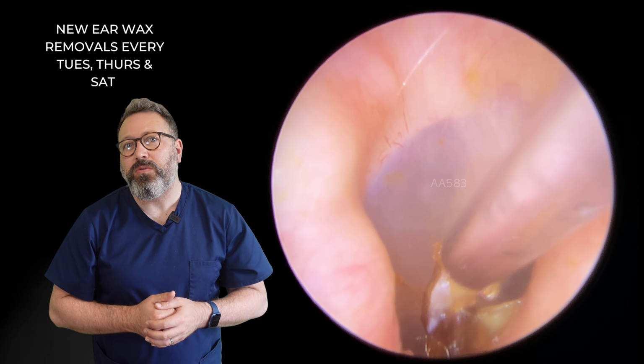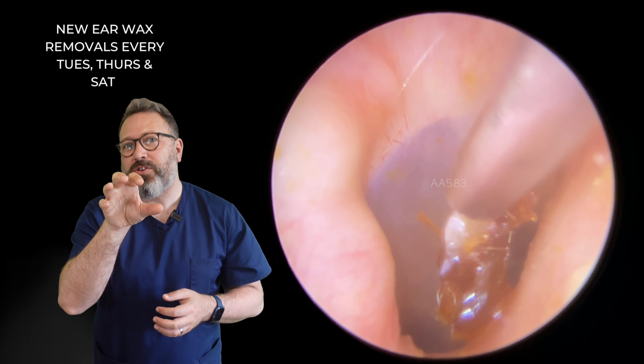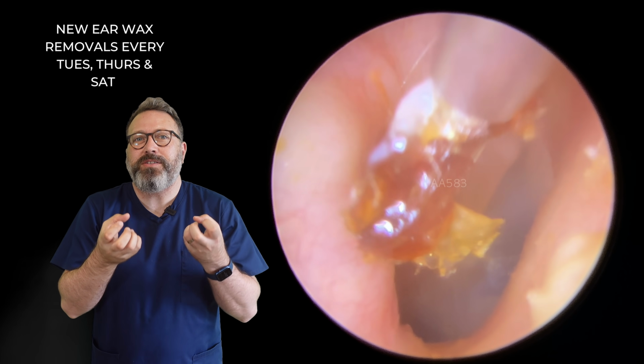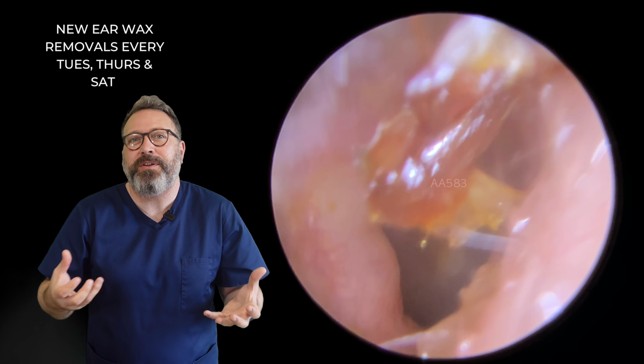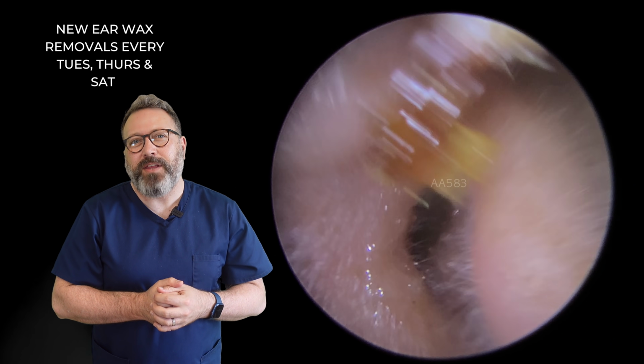So we're going to hold this on with the suction. Let's let the suction build its pressure a little bit just on this particular section, and there we go. That's the grip we needed. You can see it detach a little bit of dry skin from the one side of the canal wall there, and out that little piece comes.